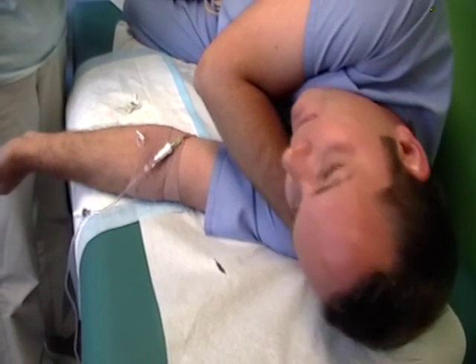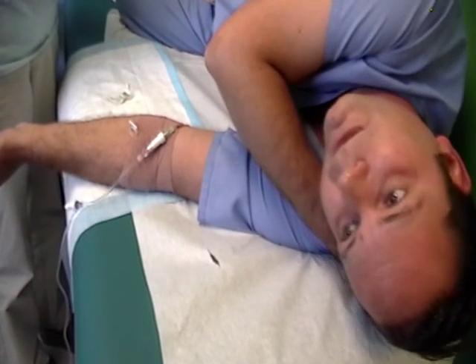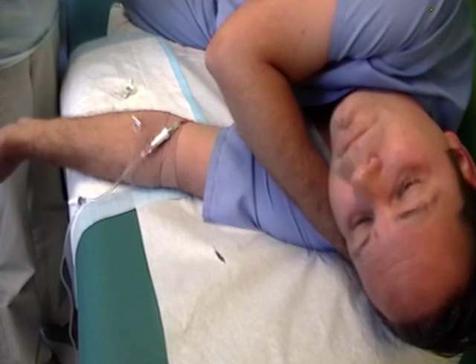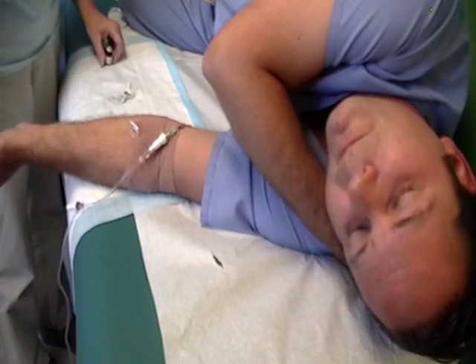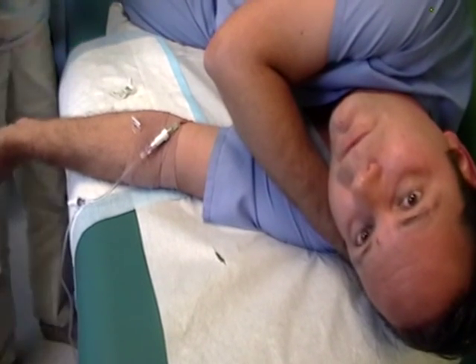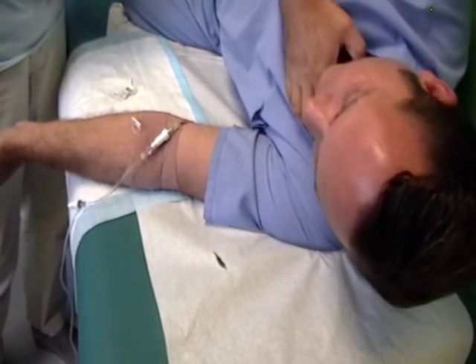First she's going to draw up the medication. She's already prepped the vial with some alcohol just to clean it off. Then she's going to withdraw the medication. If you're using a multi-dose vial, you need to inject air first so that you don't build up a vacuum. In a single-dose vial, that's not quite as important.